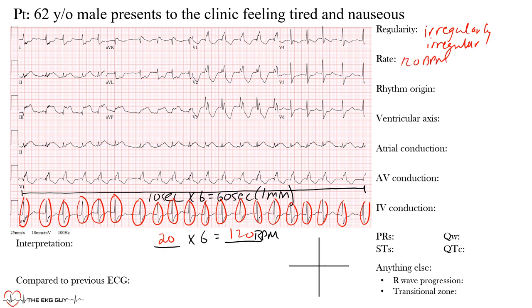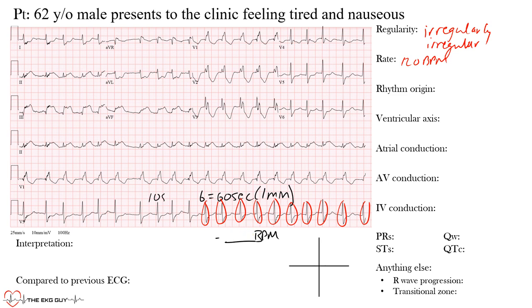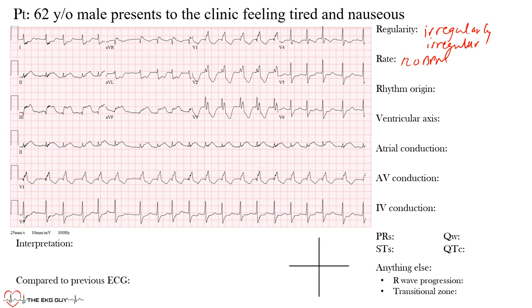That's the ventricular rate we found. If you wanted to find the atrial rate, you'd have to find P waves and count those out. You can also use T waves to find the ventricular rate. We found a ventricular rate of 120; the machine actually gives us 116 beats per minute, so we're pretty close.